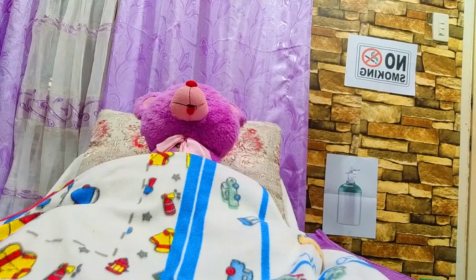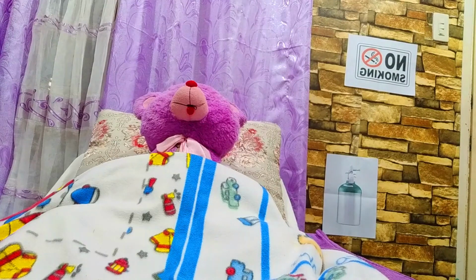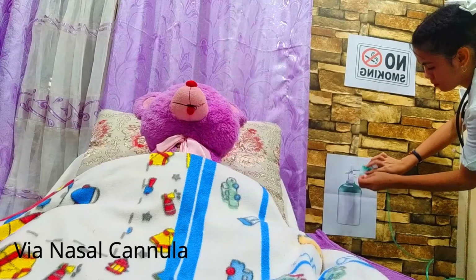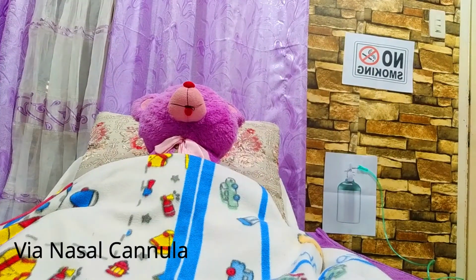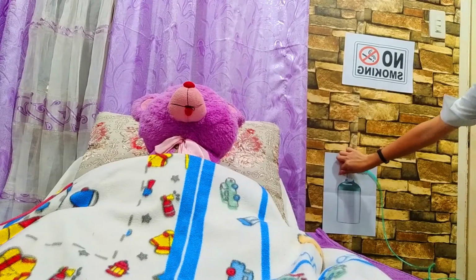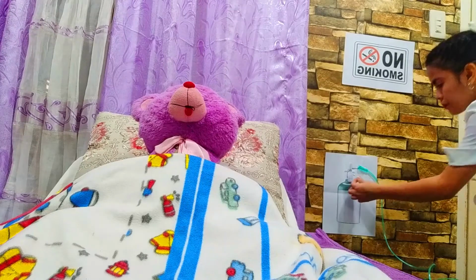The next is we need to position the client in a semi-Fowler's position. And then we need to attach the nasal cannula to the oxygen source with the humidifier. And then we need to turn on the oxygen until bubbling. And also, we need to regulate the flow meter at the prescribed liters per minute.